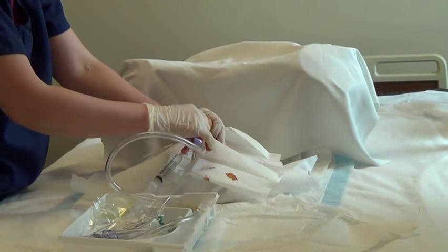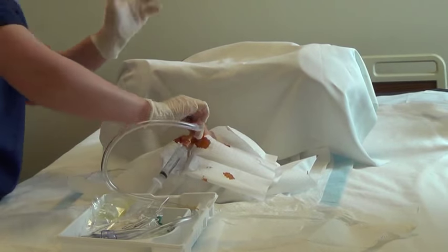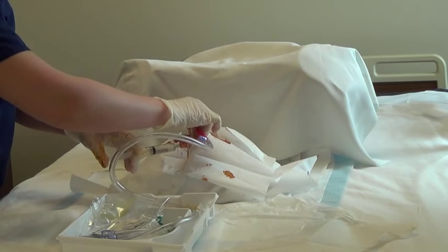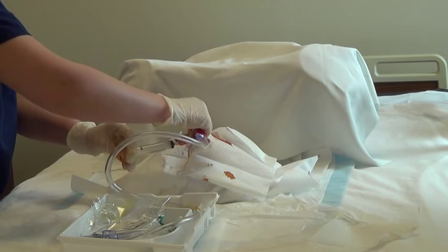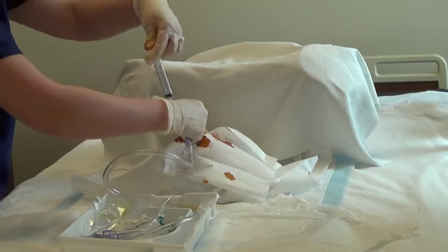Using your sterile hand to hold the catheter in place and your non-sterile hand, inflate the catheter balloon. When inflating the balloon, observe the patient. If the patient complains about pressure, immediately stop, deflate the balloon, advance, and reinflate. Inflate the catheter balloon with the entire 10 mL of sterile water. Remove the syringe.